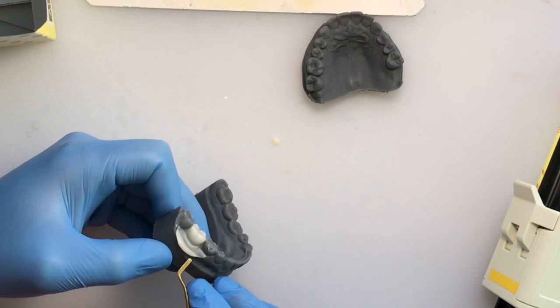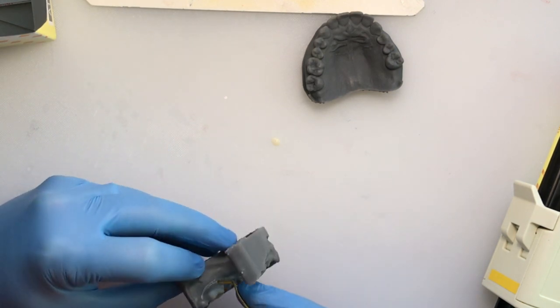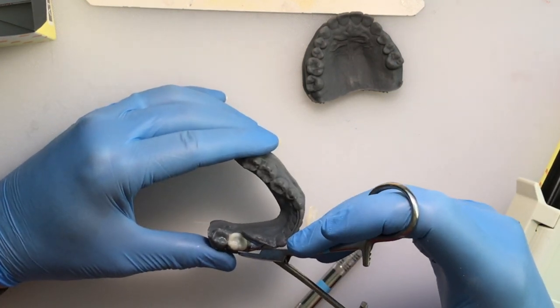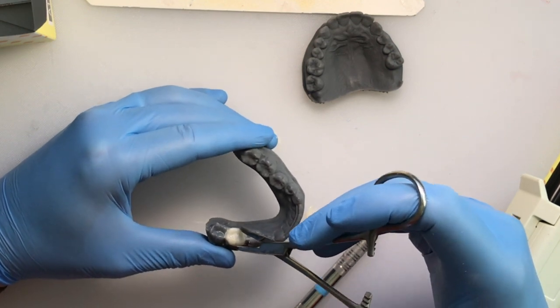You then remove the excess or flash, and carefully with the hemostat, you can now remove the crown from the model, or in your case, from the mouth. Once you've removed it, I go ahead and use a polishing wheel.